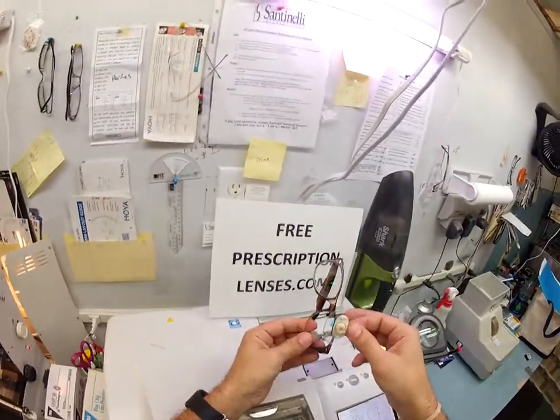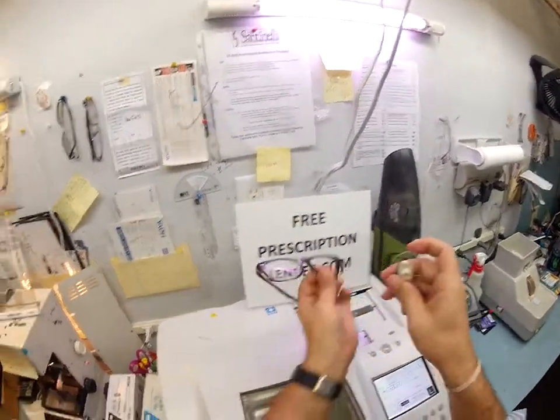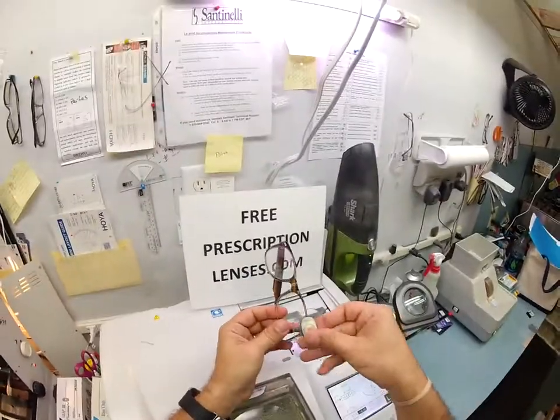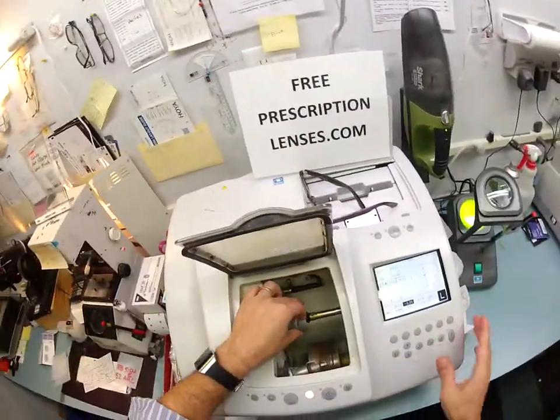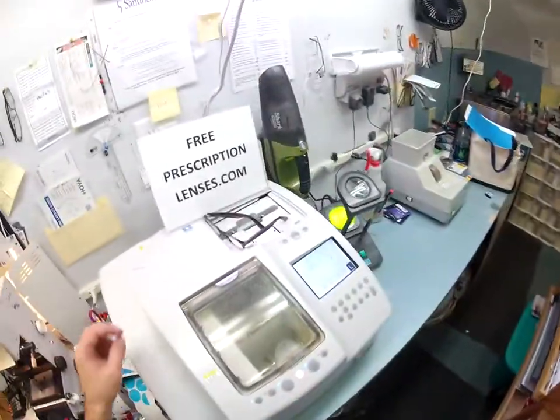Okay, so, back to work. I'm going to tuck the left lens in at the outside corner. If you noticed, I was working on the frame that way. I'm rotating where it's closest to me. I'm going to tuck it in at the outside corner, then using my thumbs, press down at the nose. Ooh, it still doesn't want to give, so because it's a slightly stronger lens, I'm going to take it down another 1/10 of a millimeter so that it will pop in easily. And then I'll get everything wrapped up and sent to you.